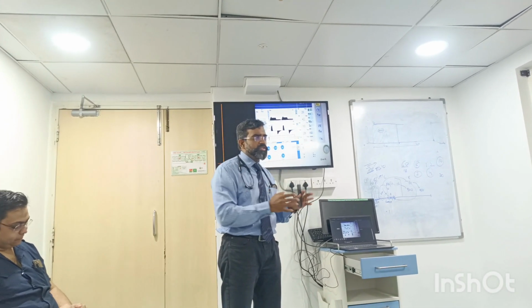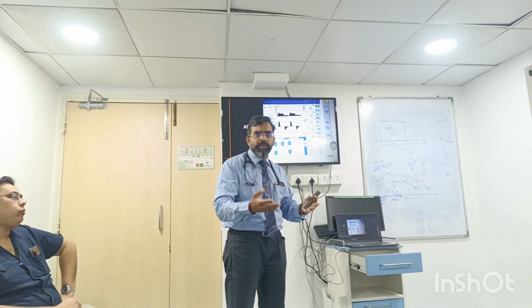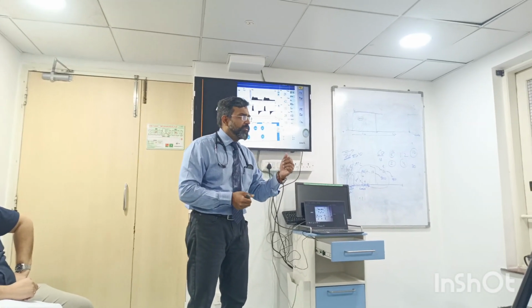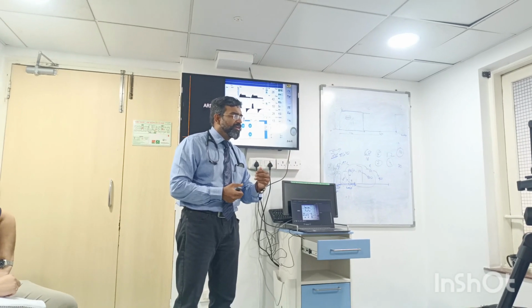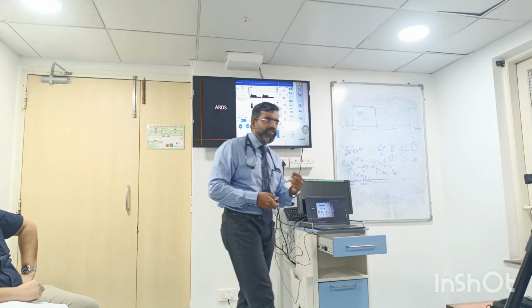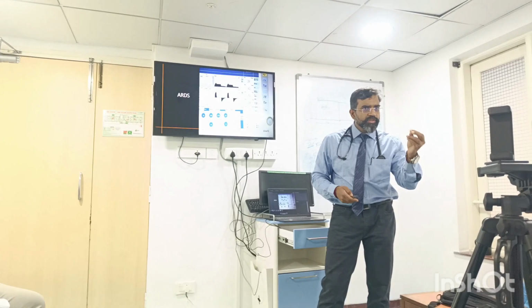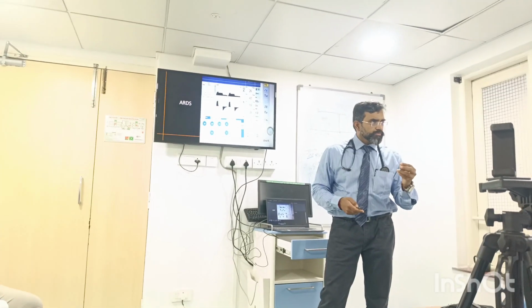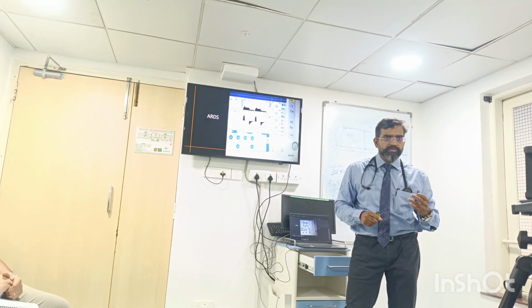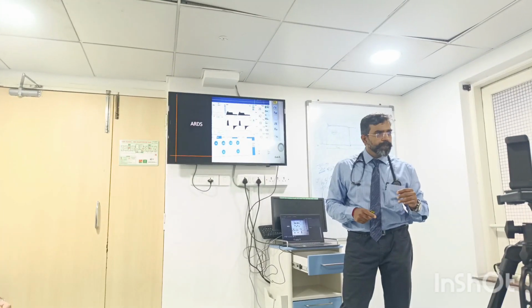Of course, this is just the ventilator. At that time I'll look at the pulse rate, BP, respiratory rate, and ultrasound, to see what's happening. For example, when we're doing recruitment, I'm doing ultrasound and seeing what has happened to my B lines. Are my B lines going? Then that is probably collapse improving. Are you understanding? I'm improving some amount of collapse. These are things that you should do on a bedside basis, because that will give you the confidence that this machine is doing what I intended it to do. You understand? If you just put the patient on and just look at oxygenation, it doesn't make sense. Right? You have to do all these things.